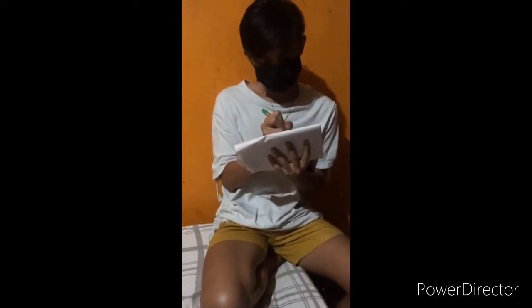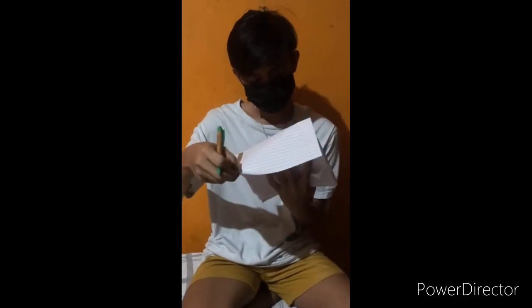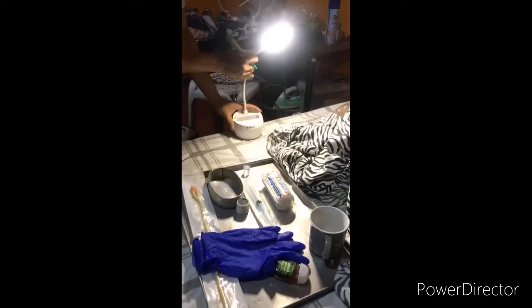Step 1. Obtain the treatment card from the nurse and check with the doctor's order. Bring equipment to the bedside table, check lighting source, identify the patient, explain the procedure to the patient, the need to keep knees positioned during the procedure, and describe the pressure sensation that will be felt during catheter insertion. The patient will feel reassured if the procedure is explained and if handled gently and considerately.